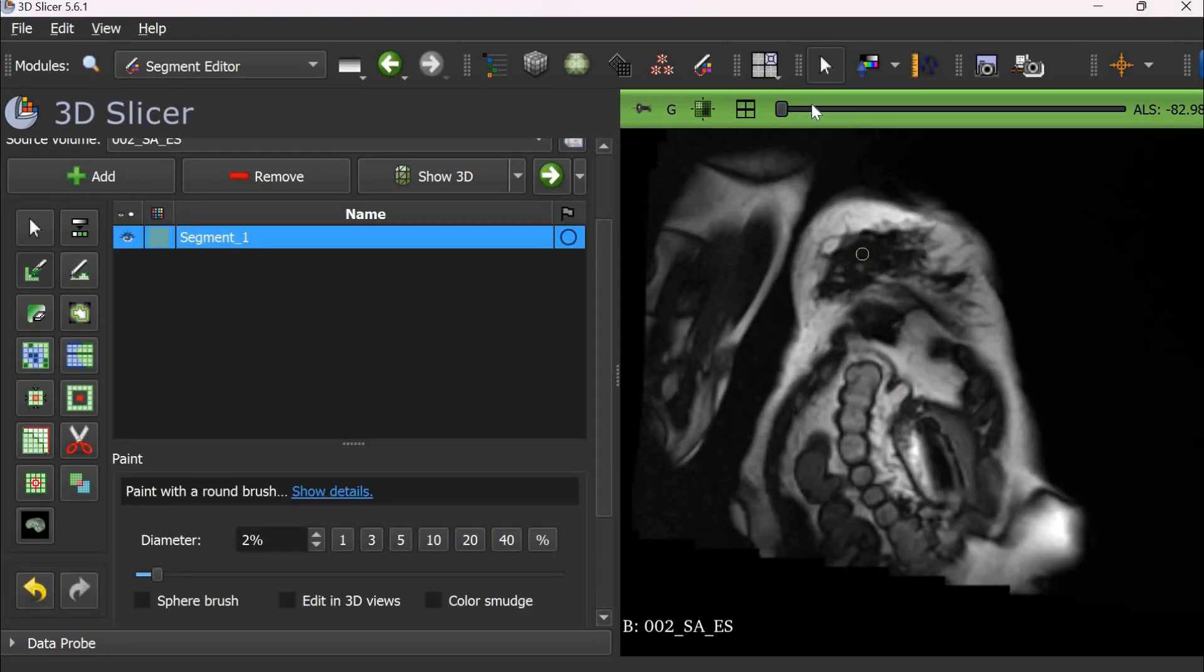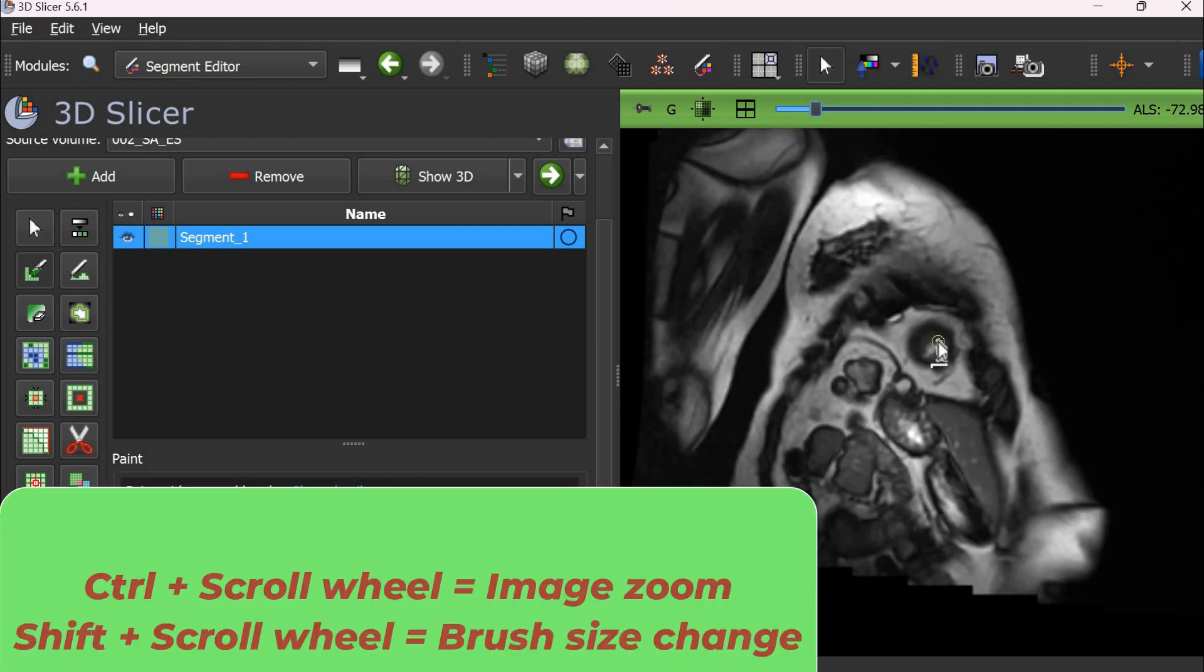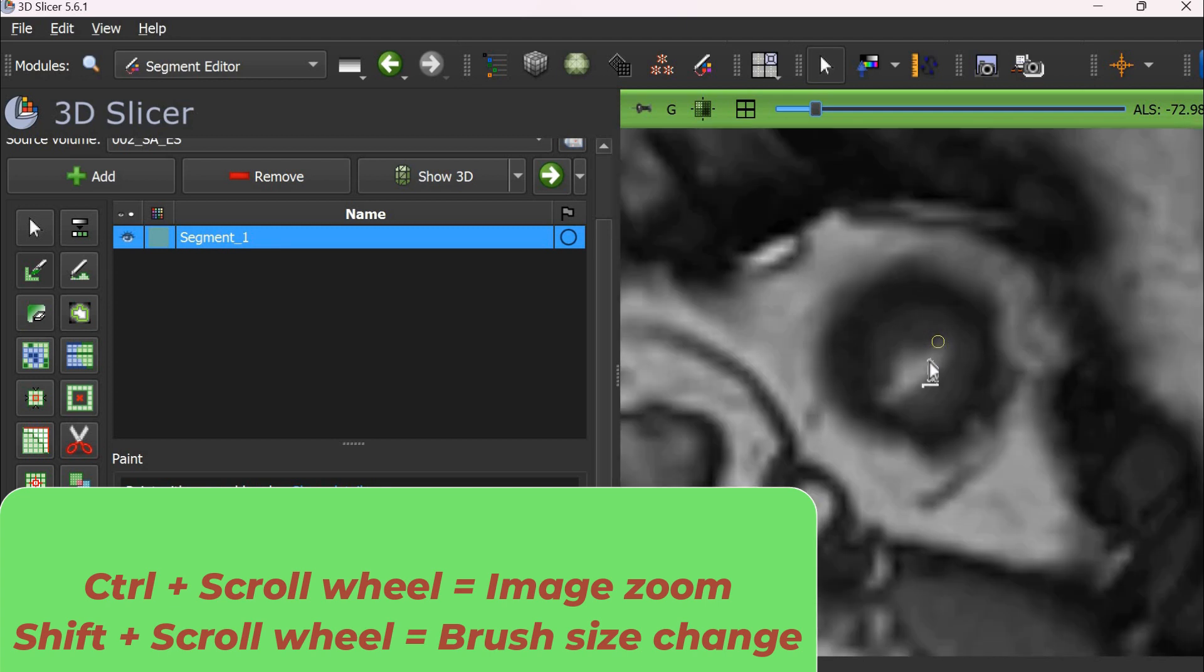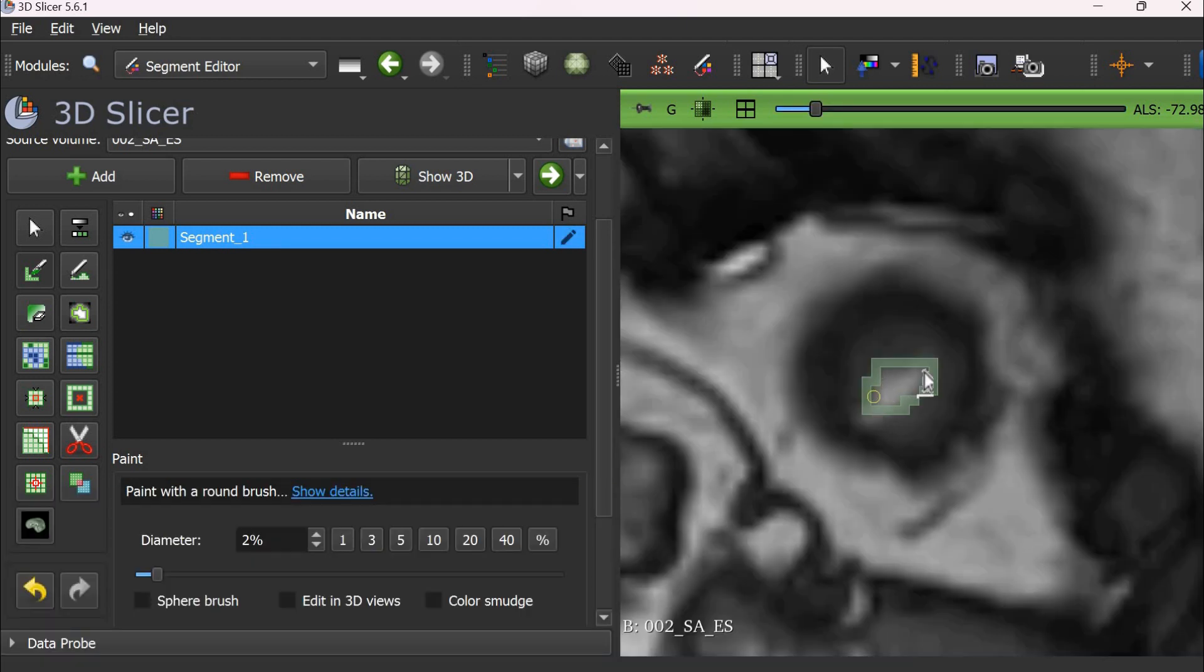Now the area is too small as compared to my brush so I can zoom in on the image using control and the mouse wheel. Then we draw the area of interest, in this case the left ventricle cavity.